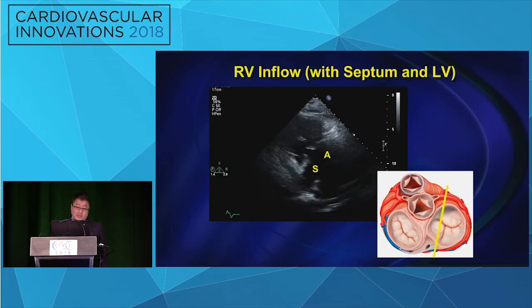If you start seeing a little bit of LV and the septum, this is not an ideal example, the septal leaflet's usually easy to identify, because if you see the septum, you have the septal leaflet. But that usually will give you a septal and anterior.